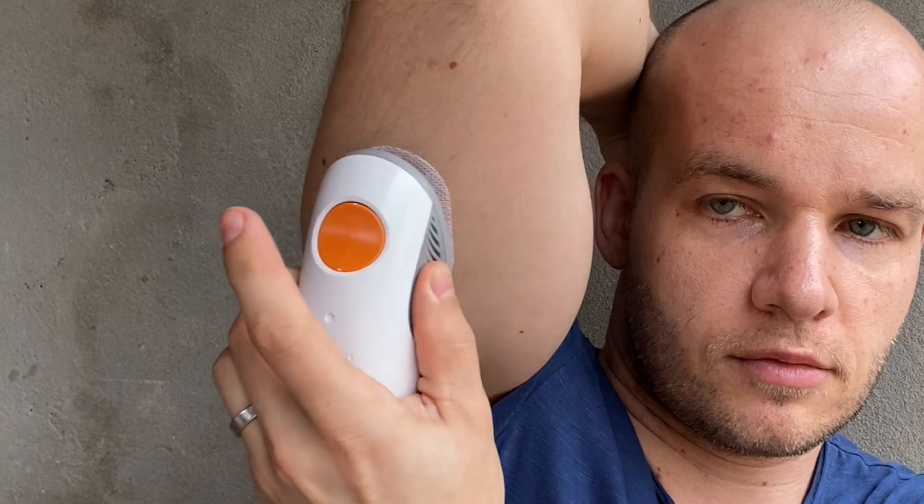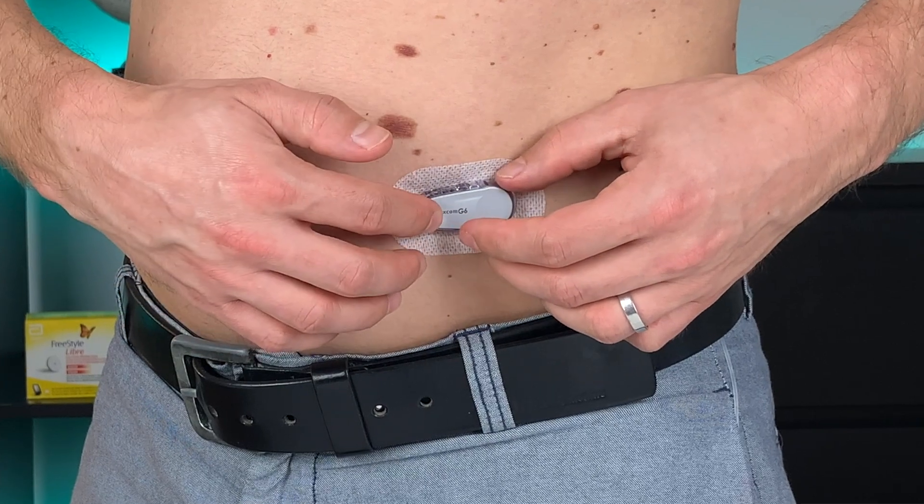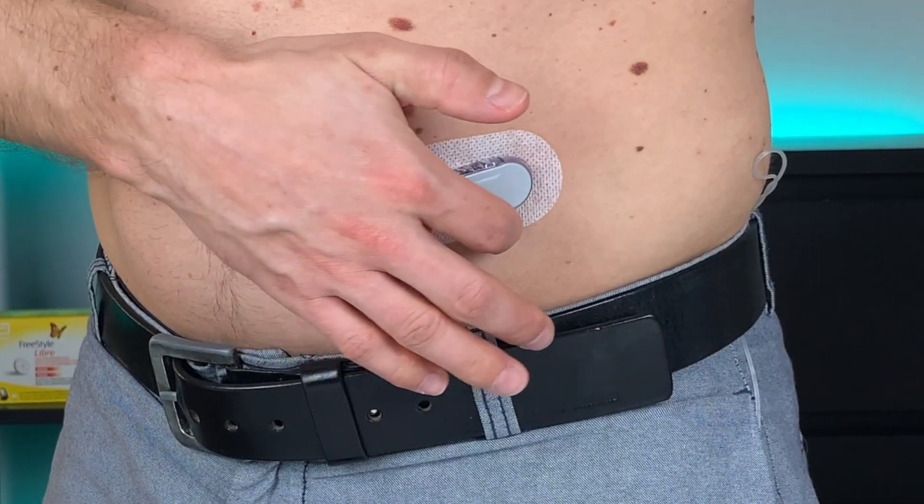Step number one is simple: pick the right spot. You want to pick a spot that's flat, where you're not sweating a lot, and where your skin is not shrinking and stretching all the time. The place might be different for different people depending on your lifestyle. When I was in Brazil I placed my sensor on my lower abdomen once and it started peeling on the first day. Because the lower abdomen is a spot where I sweat a lot and my skin moves all the time when I sit down, stand up, and when I take a shower — and the water runs right down on my sensor adhesive.